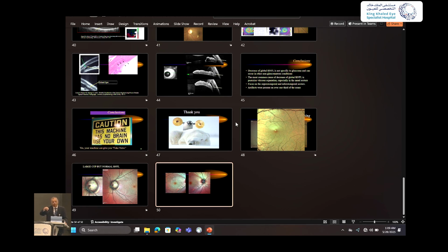And usually glaucoma affects the sides of the center. So we just ignore the foveal area and just look at the perifoveal area and the supero and inferotemporal regions. So that is one place you can look at. What happens is if you have advanced glaucoma, where there is almost no nerve fiber layer superiorly and inferiorly, and you have macular disease, then your OCT is not very useful.